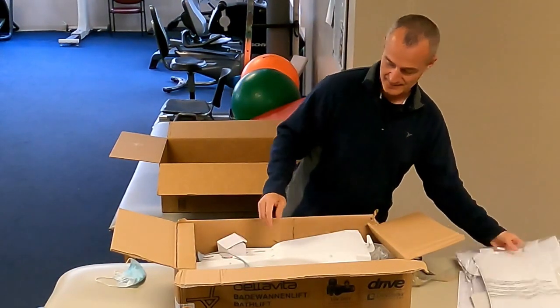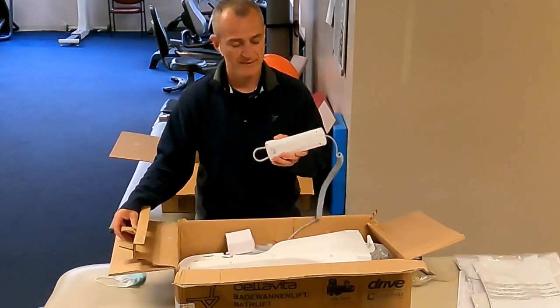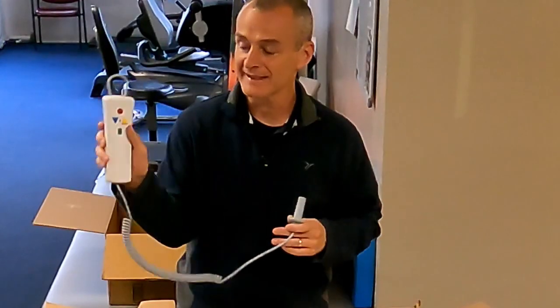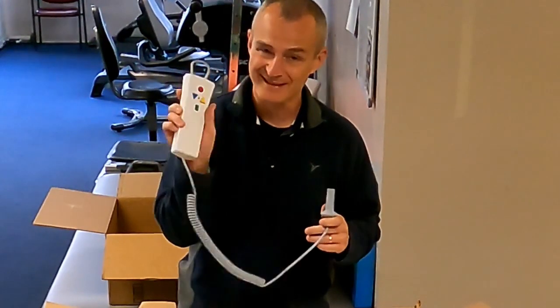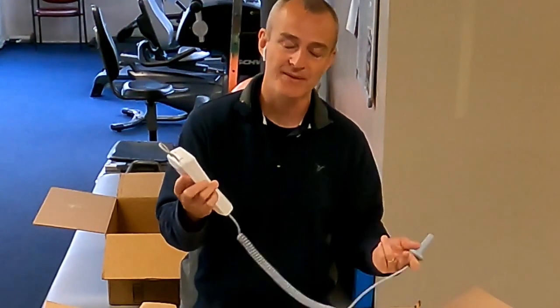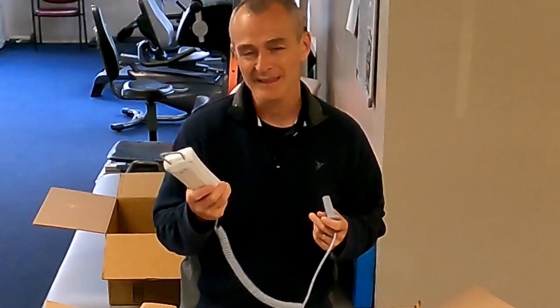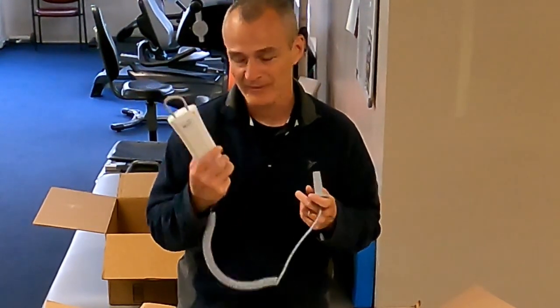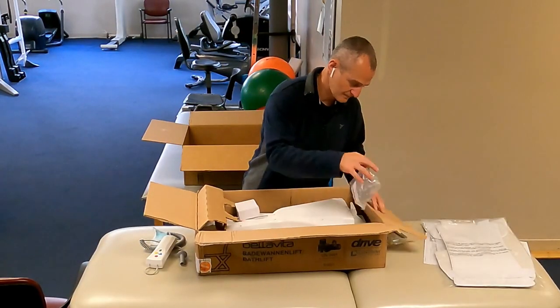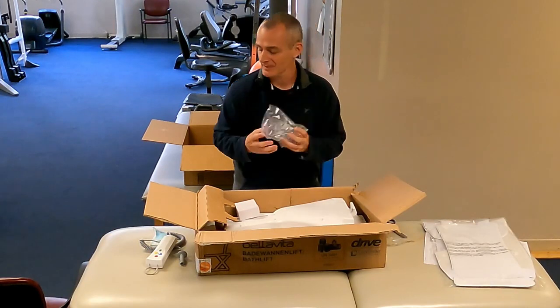This is the flexible cover for the seat — I'll set that to the side. We've got the hand control for raising and lowering the seat. I'm not quite sure what else it does, but it's color-coded. The buttons are a little small — there are some models out there with larger buttons. The controller itself is probably about three pounds just by feel. We've also got the little suction cups that go underneath the seat to adhere to the bottom of the bathtub.